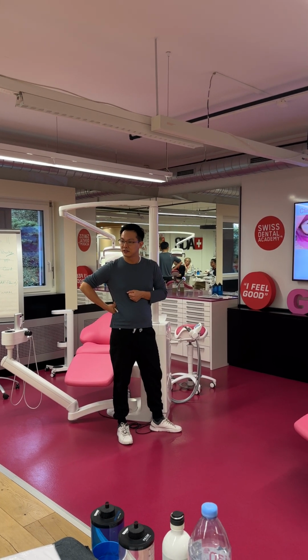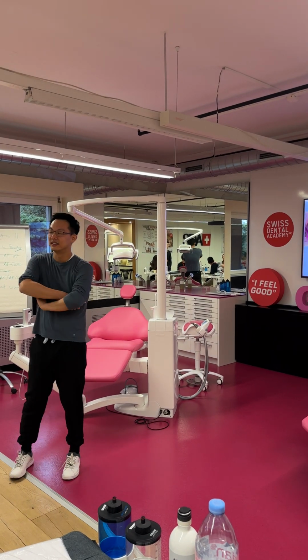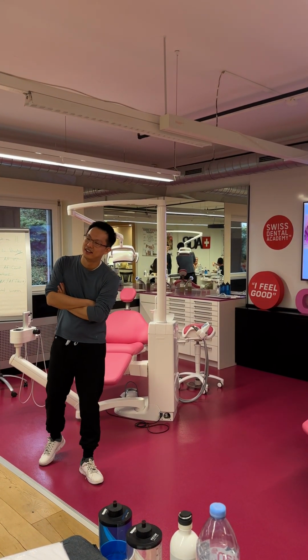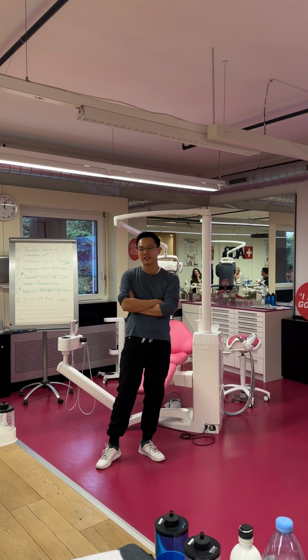Wow. How many hands do you have? I'm four-handed, but the nurse is suctioning from the buccal side. I'm moving the tongue and I'm angling it up and then suction, angling it up, suction. Because if you just try and continuously do it, it will hit the water and it just won't work.